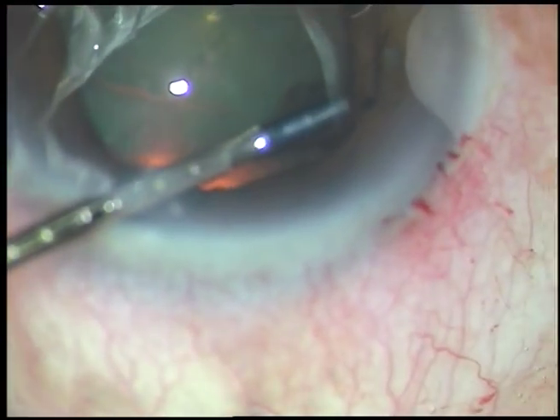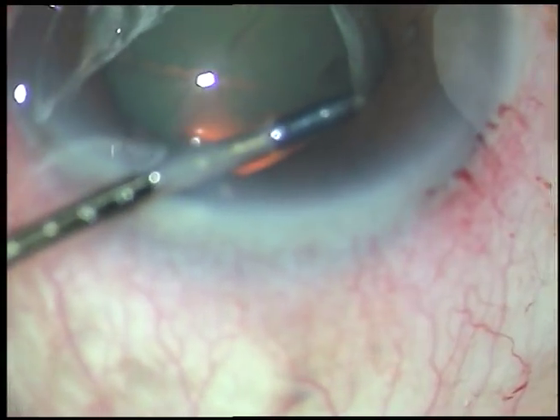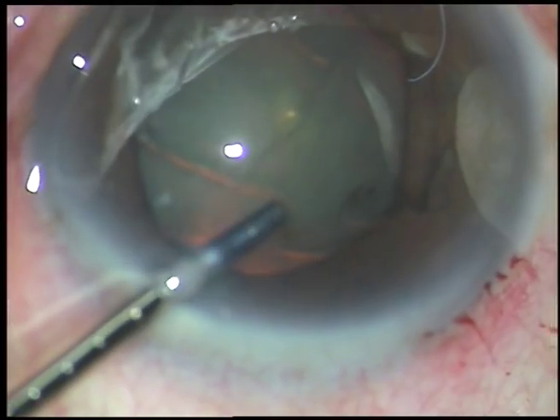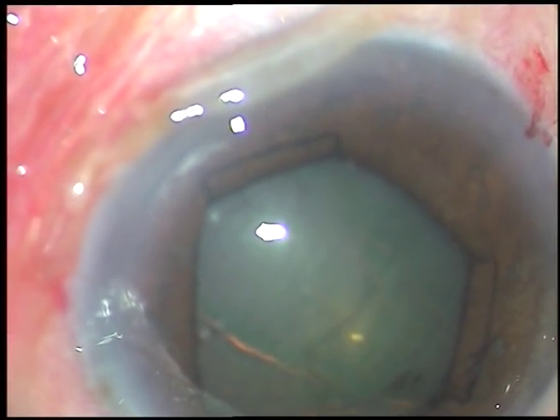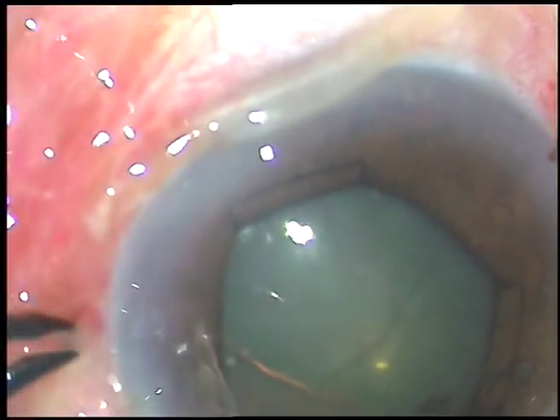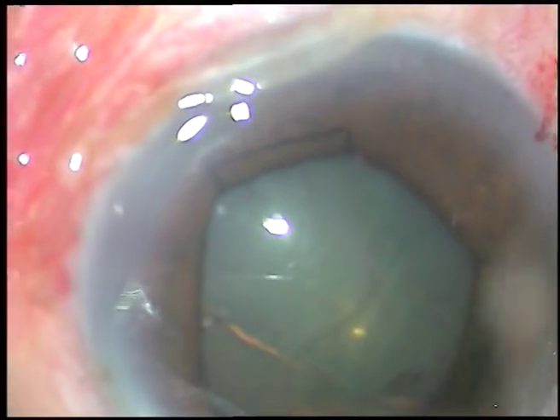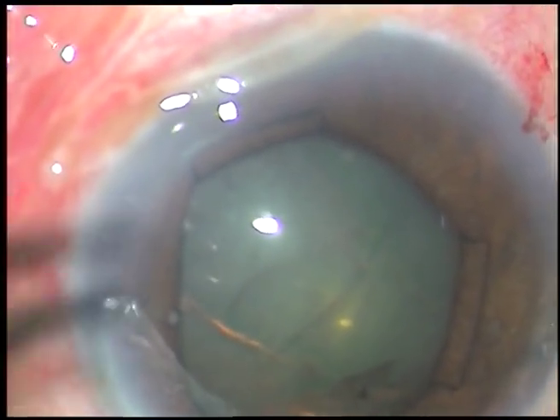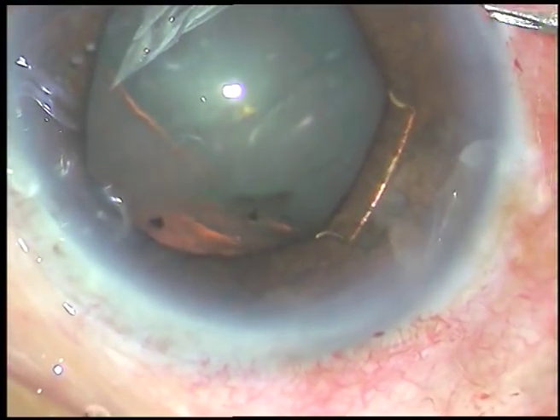This is being done with the left hand. We, the surgeons, must develop skill in our left hands — many maneuvers are to be done by the left hand. So please use your left hand many times. Be a very competent surgeon.